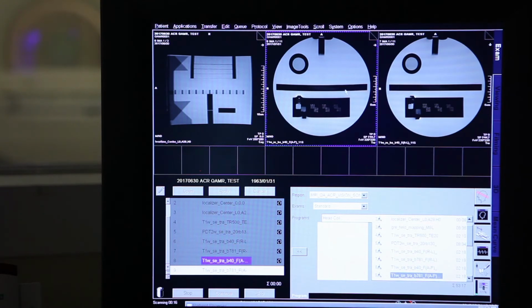I mean, you notice a geometric distortion here. It's a problem with the linearity of the gradient. Here we don't have the geometric distortion, although we have the small value. So here we have an indication of which gradients suffer from miscalibration distortions. Exactly. Now, we finish the high bandwidth.